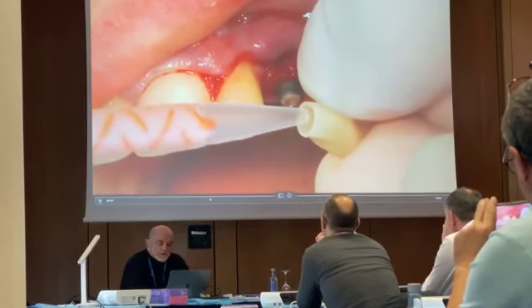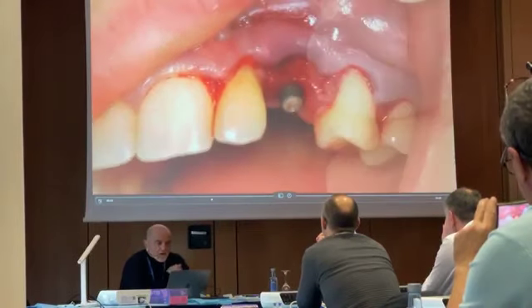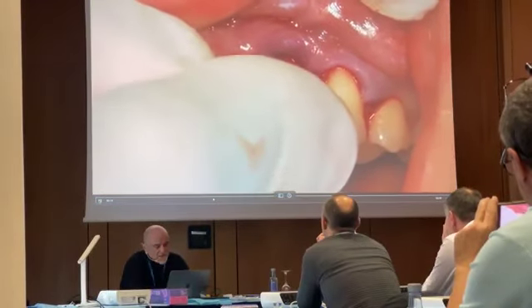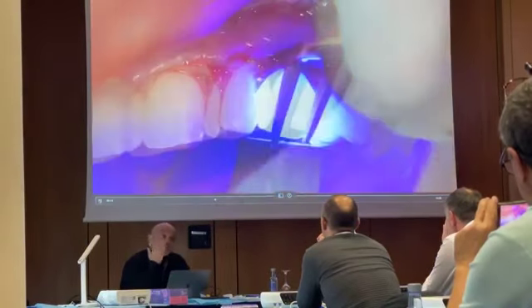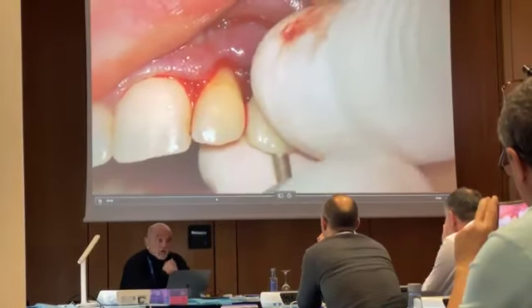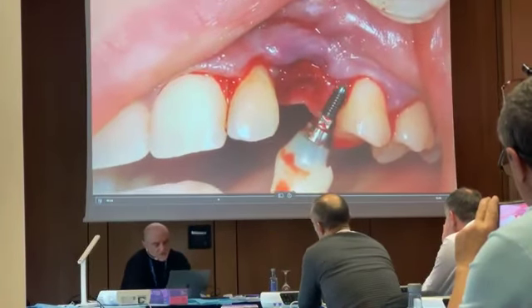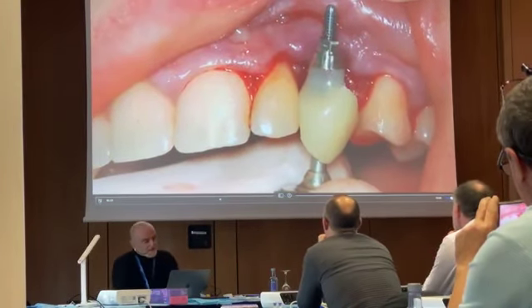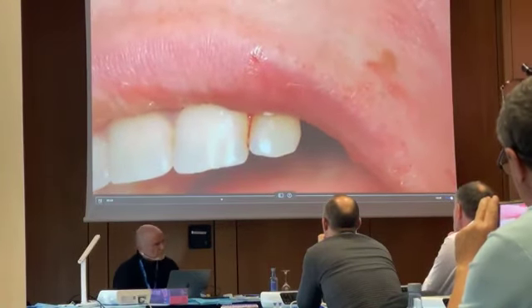You will see how this temporary crown, since it was built on the same impression that was used for creating the surgical stent, you really can rebase this temporary crown in a few seconds, because we need a surface, convex surface, onto which we can advance our coronally advanced flap in order to completely cover the connective tissue. So this is the precision. You see that there is almost no excess of resin between the temporary crown and the T-base, I think. So I think it's called T-base.